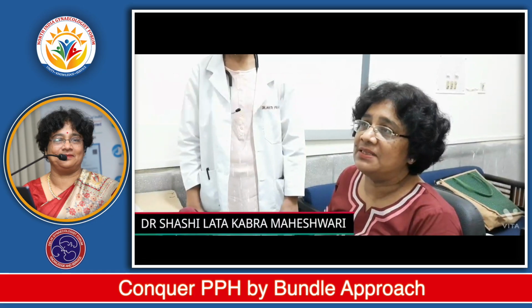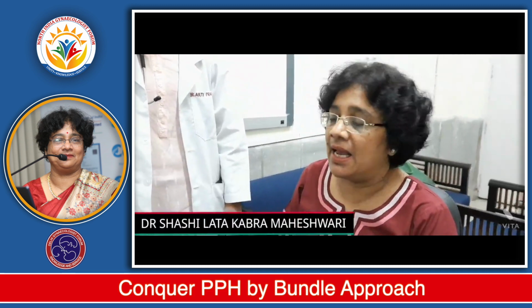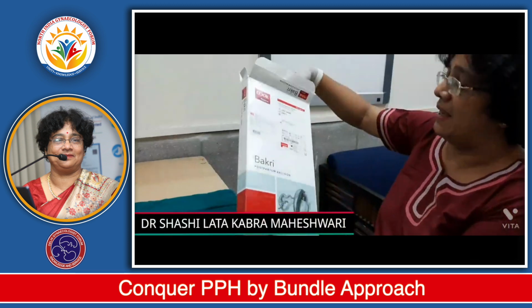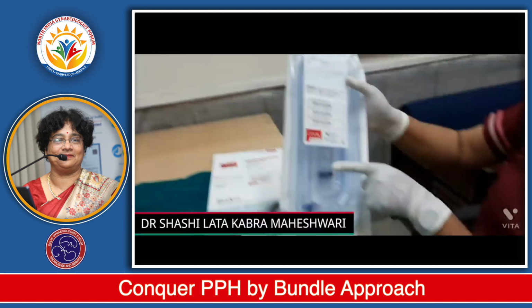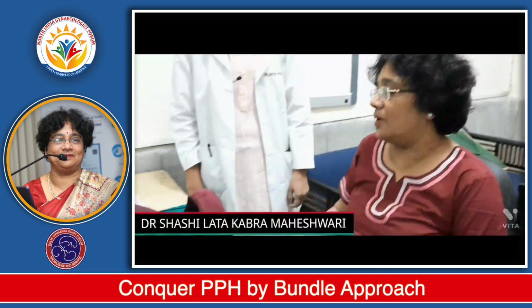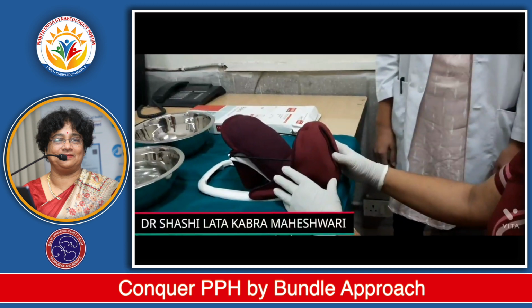Balloon tamponade is the first surgical method for the prevention of PPH after the medical management fails. And today I will show you the insertion of Bakri balloon. This is Bakri balloon, and the pack comes like this. It has a 50 cc syringe and the balloon with the channels. So this is the model of uterus, and I will show you the insertion of Bakri balloon in this model.